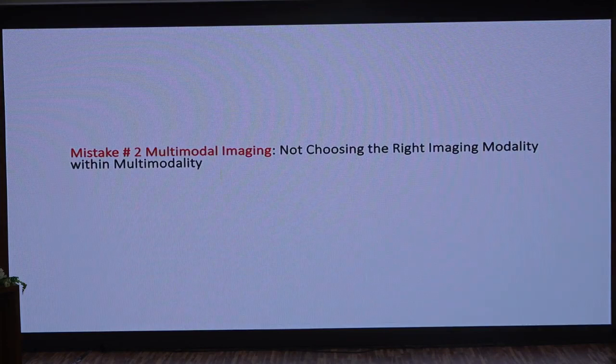The second thing is multimodal imaging is the buzzword. Everybody loves MMI, nobody understands it if you ask me, but everybody talks about it. So MMI comprises 6-7 imaging modalities and you have to combine them. But the problem is, as a younger colleague, you don't know which investigation or which imaging modality to do and for what. So I'll show you an example.